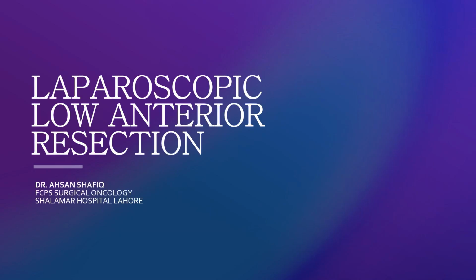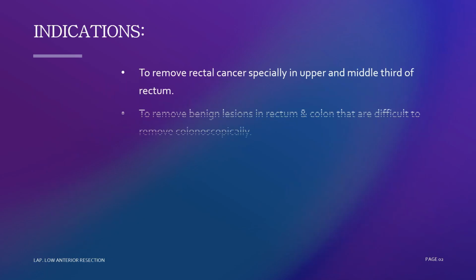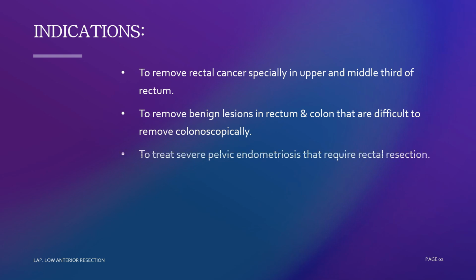Laparoscopic Low Anterior Resection. A video case presentation. Indications: to remove malignant and benign rectal lesions, to treat pelvic endometriosis, traumatic colon, diverticulitis, Crohn's and ulcerative colitis in refractory cases.